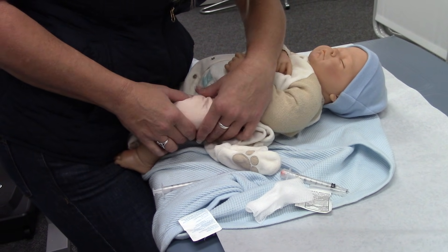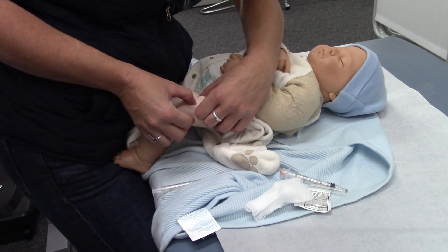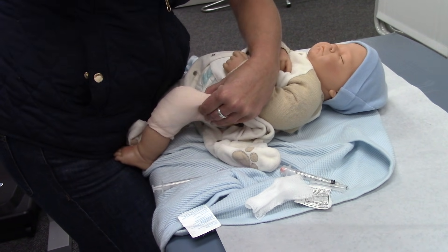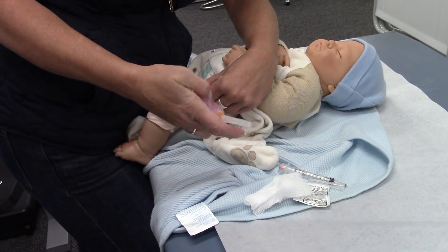For sub-Q, I'm going to take that same upper, middle, outer third. I'm going to put my thumb on the femur, but I'm going to pull up the bulk. I'm going to go in at a 45-degree angle this time.